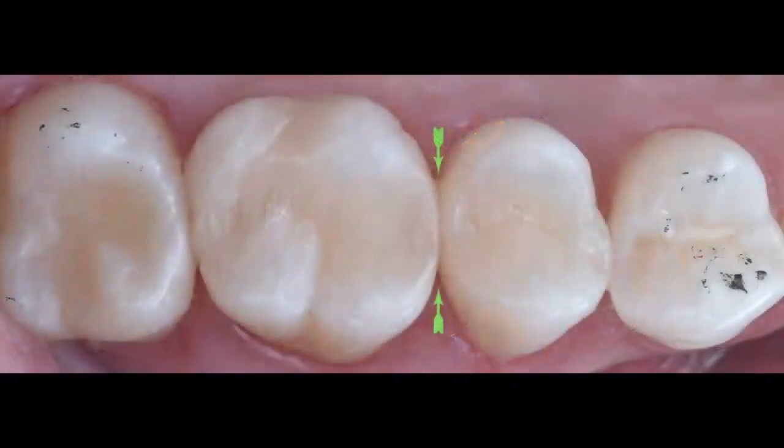And at the end of my restorations, you can see how I was able to reestablish not only a very nice and wide contact, 2 to 3 millimeter buccal to lingual width, but look at the buccal and lingual embrasures. They're very nice and uniform. They are similar in shape and size to the neighboring buccal and lingual embrasures with the adjacent teeth. So again, we have accomplished our goal of not only reestablishing an ideal and anatomical contact, but at the same time an ideal and anatomical buccal and lingual embrasure for this patient.